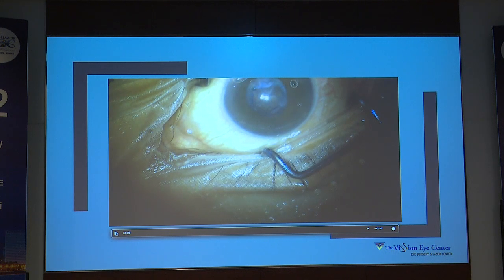So now comes an interesting phase where the epinucleus is stuck, you have capsulocortical adhesions, and you want to go ahead and remove it. What I do here is more of hydrodissection, subluxate the epinucleus into the anterior chamber if I can, or just out of the bag, and then catch it by the neck and go ahead with the next part. This was to show you my mistakes which I made, which you should be avoiding.